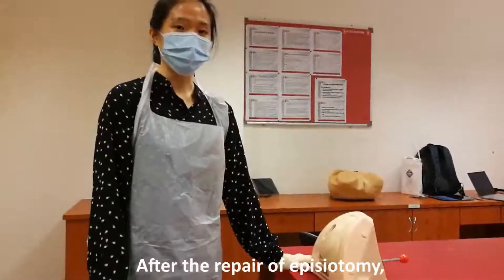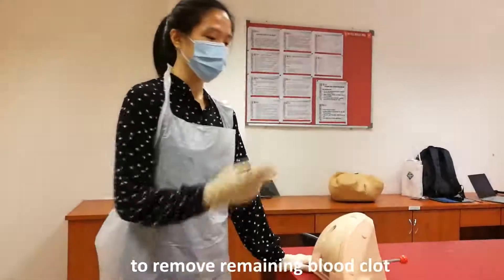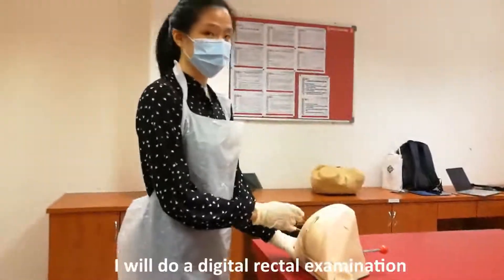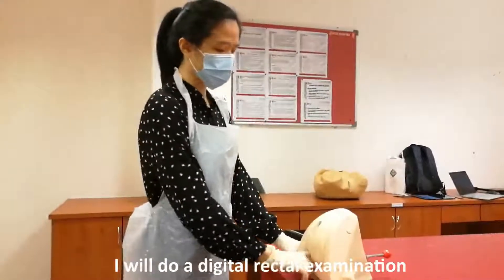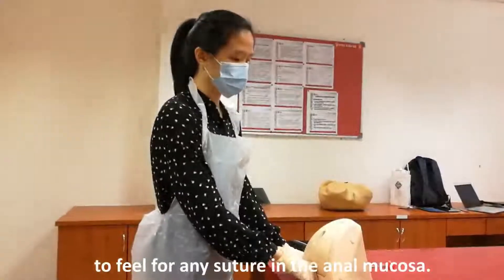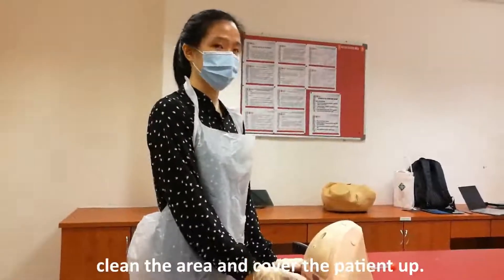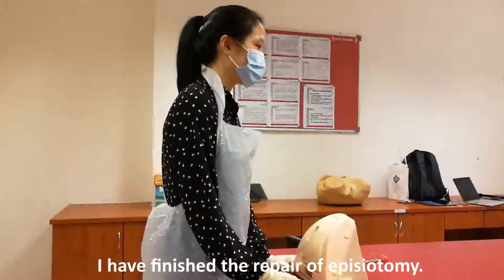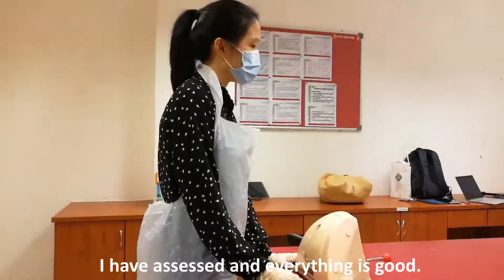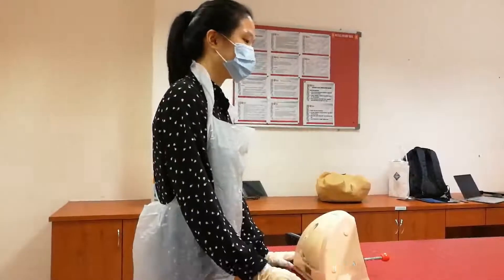After repair of episiotomy, I will do a vaginal examination to remove remaining blood clots and also check for any foreign bodies. I will also do a digital rectal examination to feel for any sutures in the anal mucosa. After everything is done, clean the area and cover the patient up. Madam, I have finished the repair of episiotomy for you. I have assessed and everything is good. I will cover you up. Thank you, Madam.